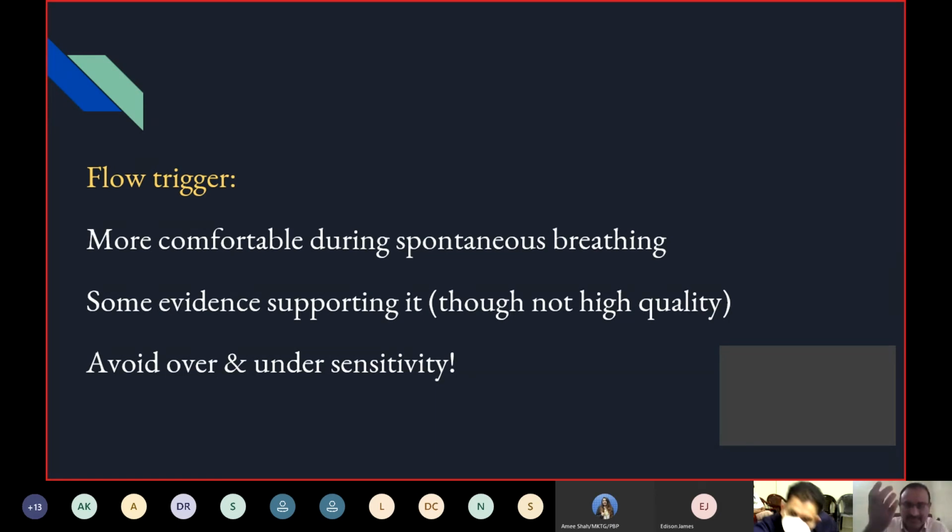And then when the patient takes a breath, there is a change in the inspiratory flow and the expiratory flow. So the machine is looking at the inspiratory flow and the expiratory flow. When there is a change in the flow, it will sense that as an inspiration starting, and it will give the breath. It will help the patient.